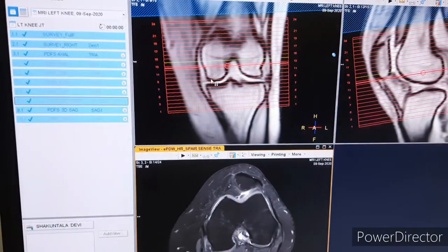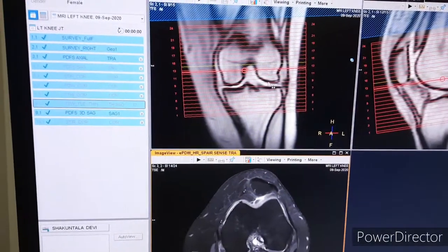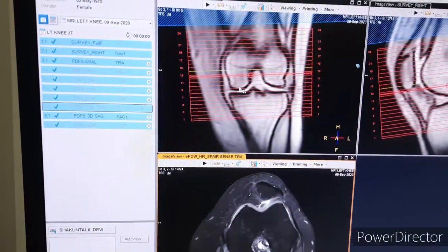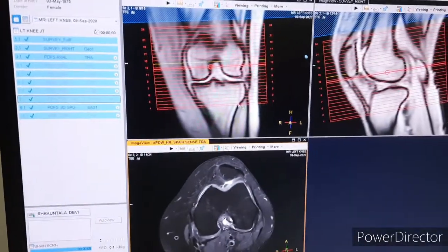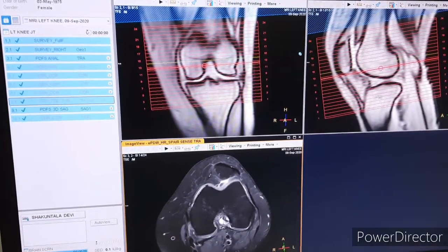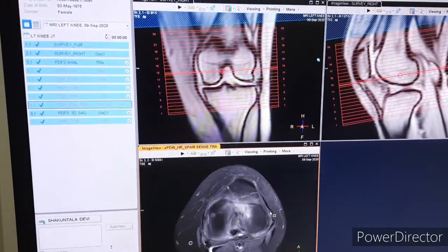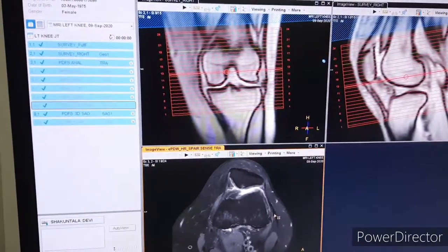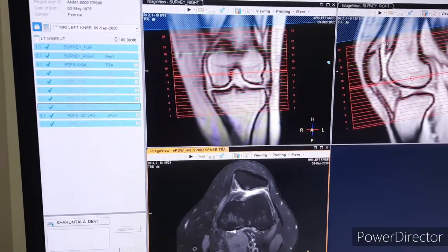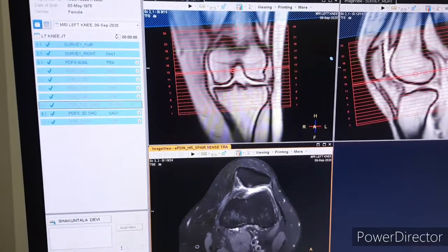The reference line we have taken here is the condyle of femur. You can see here the lateral and medial condyle of femur. On coronal we have planned — you can see it on the sagittal as well. You can see the scan area; we have covered the patella.